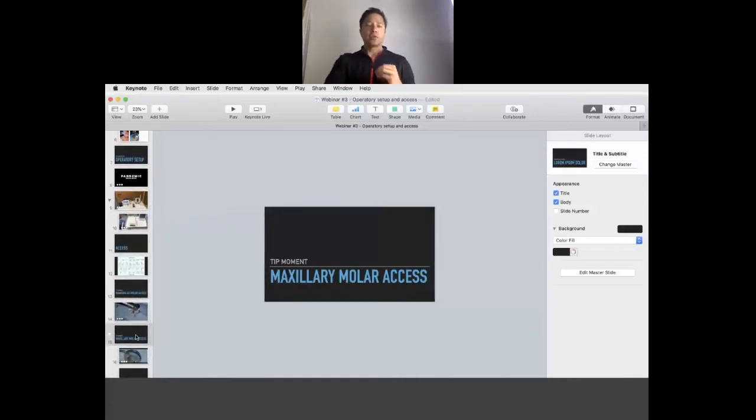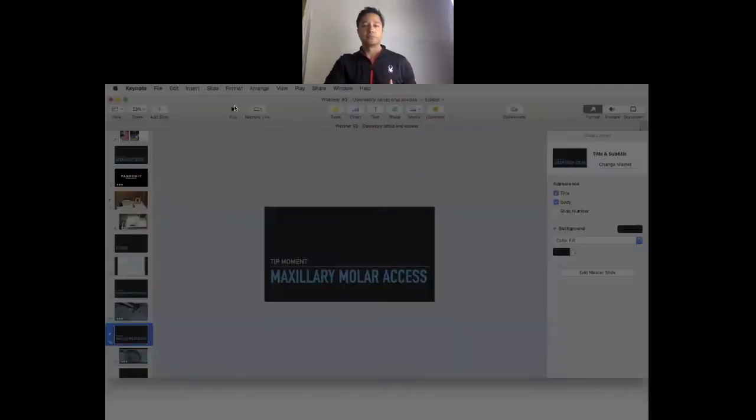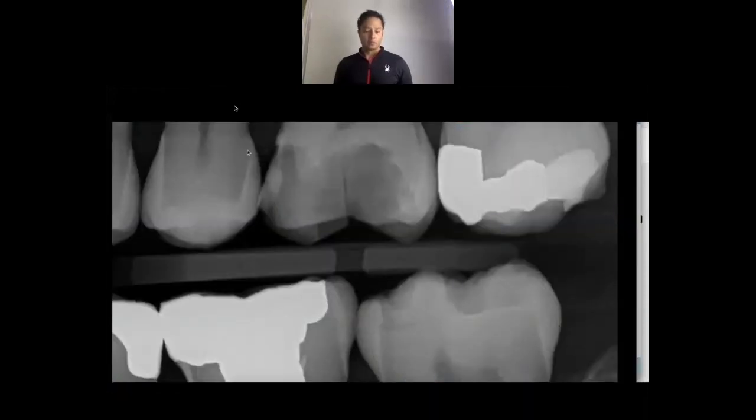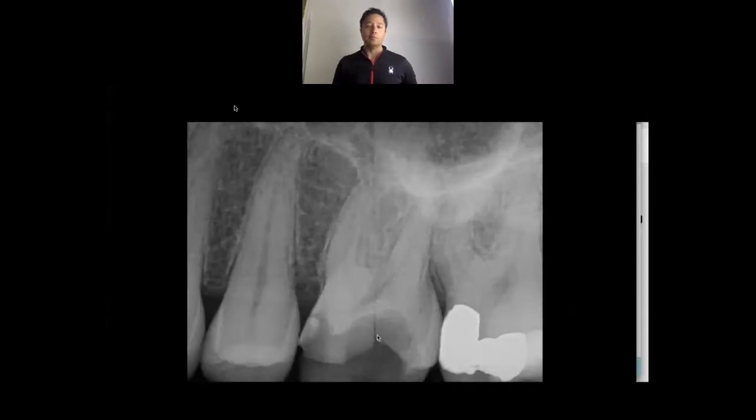That's talking about a mandibular molar. Now let's look at a maxillary molar. This is a very interesting case from the clinic that we worked with one of our captains on. So this is a cracked tooth case — let's talk about accessing into a maxillary molar. This tooth was presented as an emergency case. On the bite wing you can see the patient had long lost the restoration and now had symptomatic irreversible pulpitis. On the periapical radiograph you've got that really interesting fracture right down the center of the tooth.